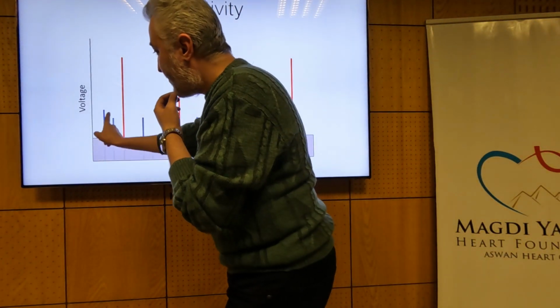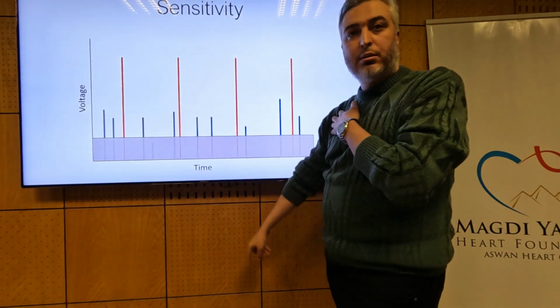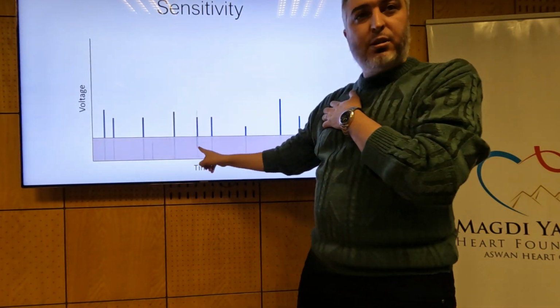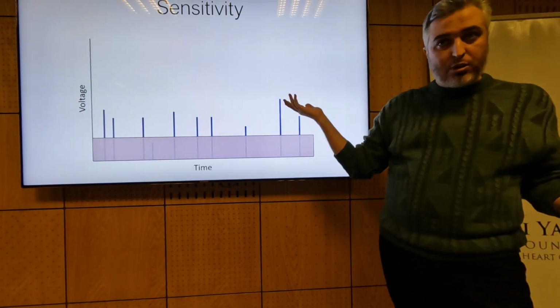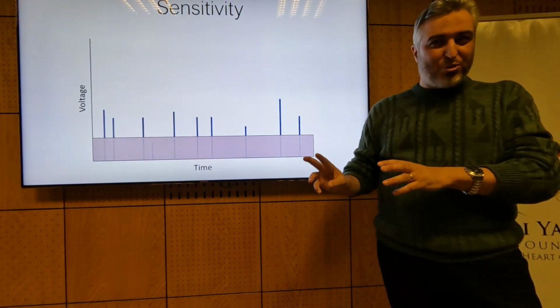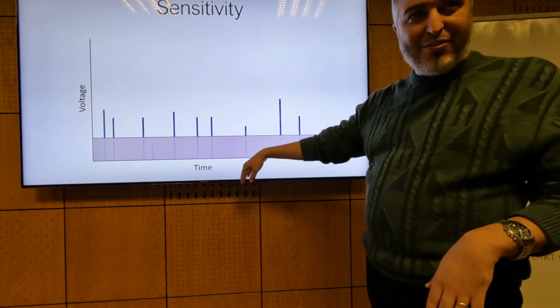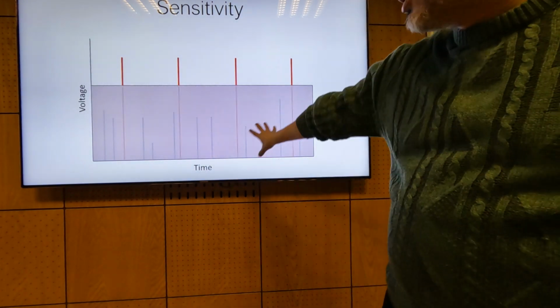You'll actually sense the noise as ventricular activity. So the pacing gets inhibited. What if the patient does not have ventricular activity? Inhibited, and the patient does not pace, while actually there is no ventricular activity. And then the patient dies. Okay? So, I'm sorry, adjusting the sensitivity is important, and we have to get that right. Because if you ignore anything, you get VF, and if you sense everything, you actually might not be able to protect patients with no activity. So you want this.